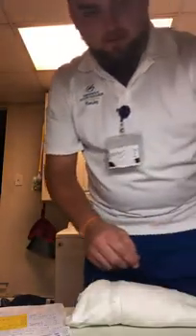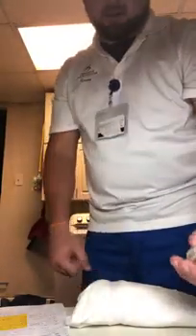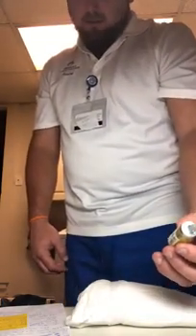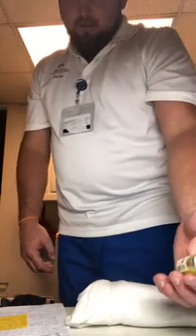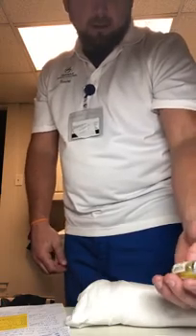Now we have the B12. We're going to do the 6 R's again. We have patient Anna Pawlowski, date of birth 5/5/57. She's ordered to have a SubQ injection of B12, 500 micrograms. We have to do the calculation like I said before. It adds up to be 0.5 milliliters that we're going to put in the syringe.